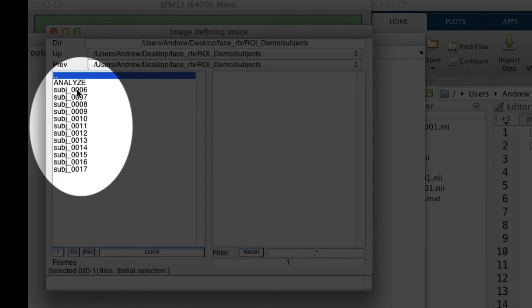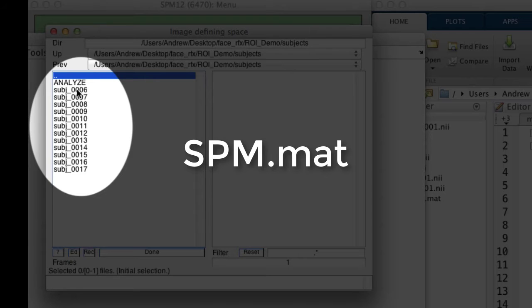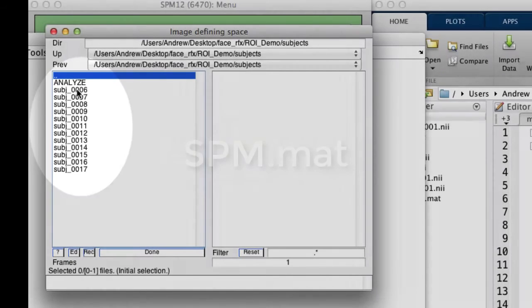When you run a second level analysis, it creates a file called spm.mat, which has information about where each of those Rubik's cubes or contrast images are stored. It's an important file, and we'll be using it later.